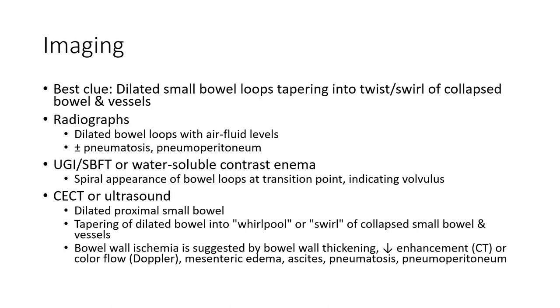Upper GI or small bowel follow-through shows the spiral appearance of the bowel loop, with a transition point indicating the volvulus. Contrast-enhanced CT shows dilated proximal small bowel tapering into a whirl of collapsed small bowel and vessels. Bowel wall ischemia is suggested by bowel thickening, decreased enhancement, decreased color flow on Doppler, pericolonic edema, ascites, pneumatosis, or pneumoperitoneum.